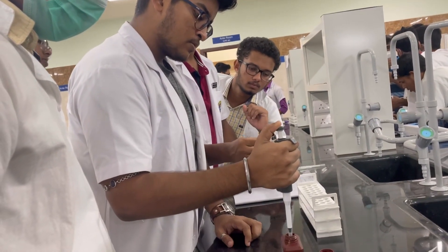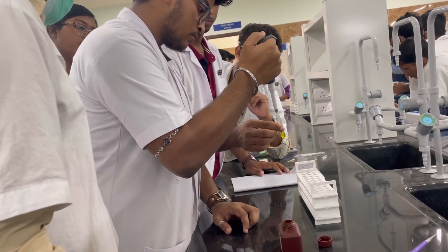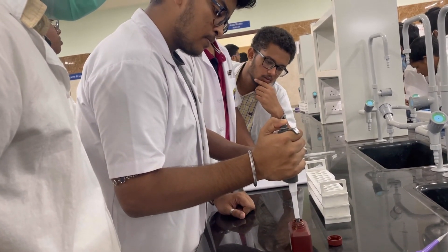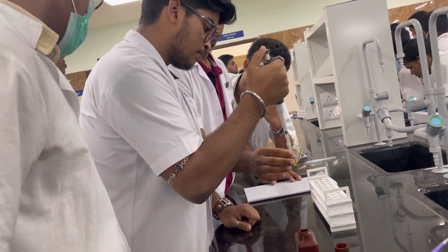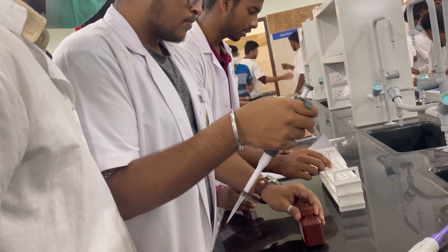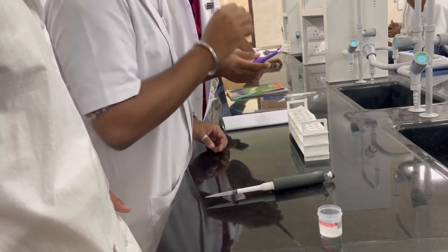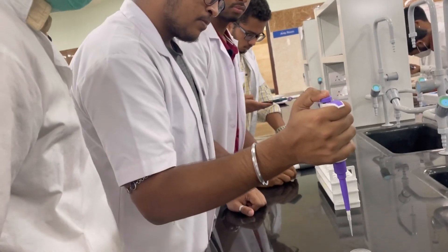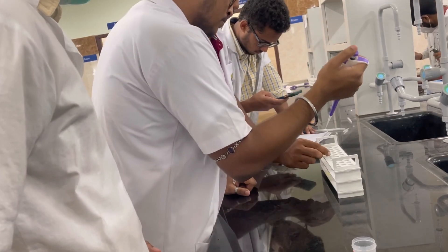Here Rakesh is performing the experiment. 2000 microliters of picric acid reagent is added to a test tube. 200 microliters of the sample is added to the solution. A buffer of 100 microliters is also added to the solution.